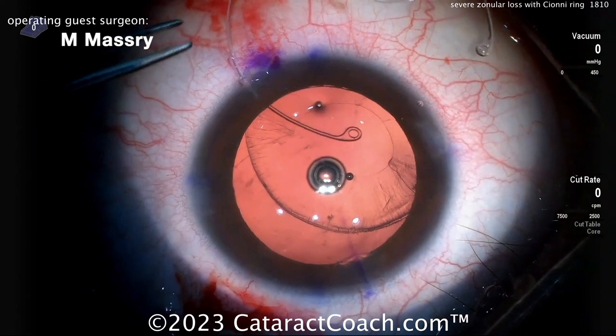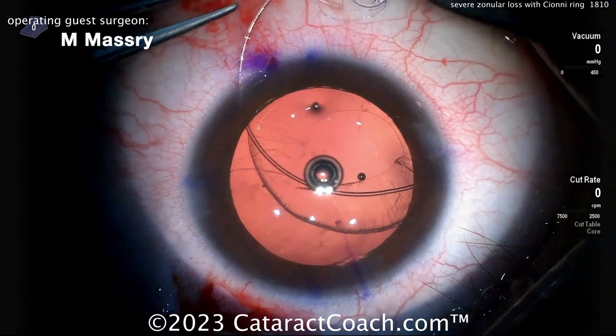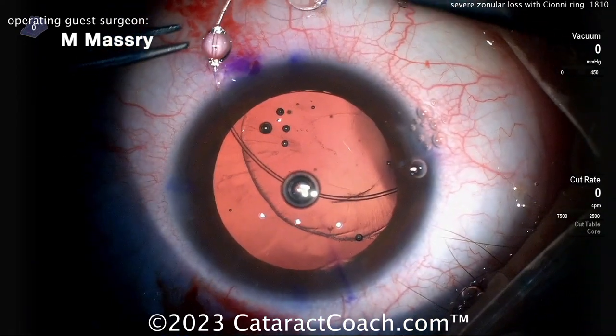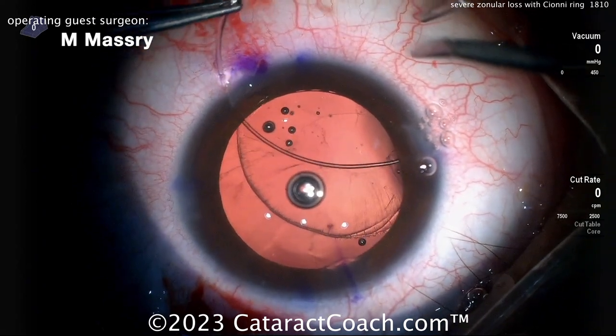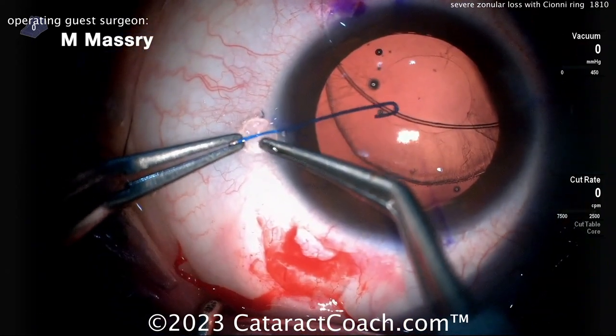Now threading the Siône ring inside the eye — here it comes. You may want to use two hands, getting a hand inside the eye to allow that Siône ring to go around the capsular bag equator without putting too much stress on it. You can easily puncture the capsular bag, which you don't want to do, so using a second hand in the eye like a hook can be very helpful.